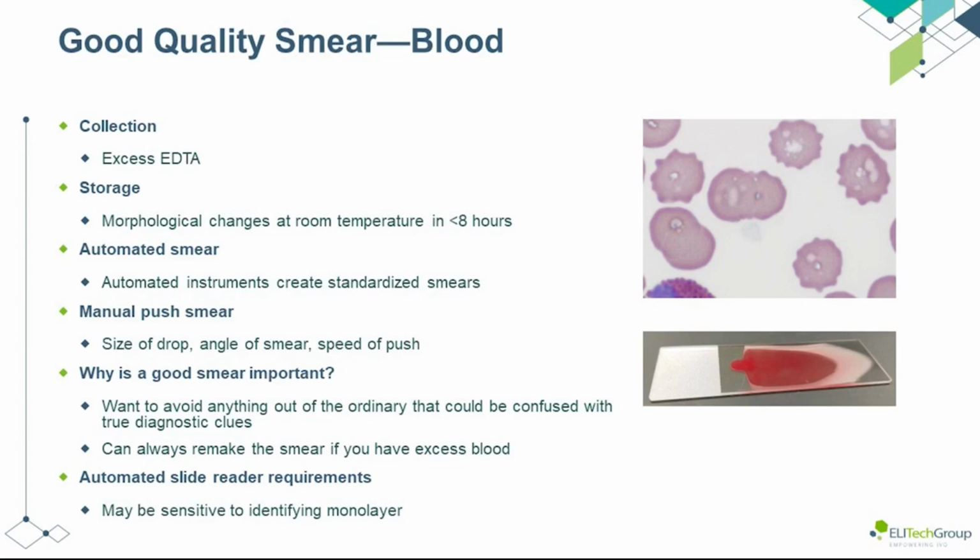A well-made blood smear should be 2/3 to 3/4 the length of the slide, with a slight rounding at the feathered edge to provide the largest area for examination. The smear should be thin enough that only a few erythrocytes are touching in the 100x field. The size of the blood drop used, the patient red blood cell count, the angle at which the spreader slide is held, and the speed at which the slide is made all affect the thickness of the blood smear.